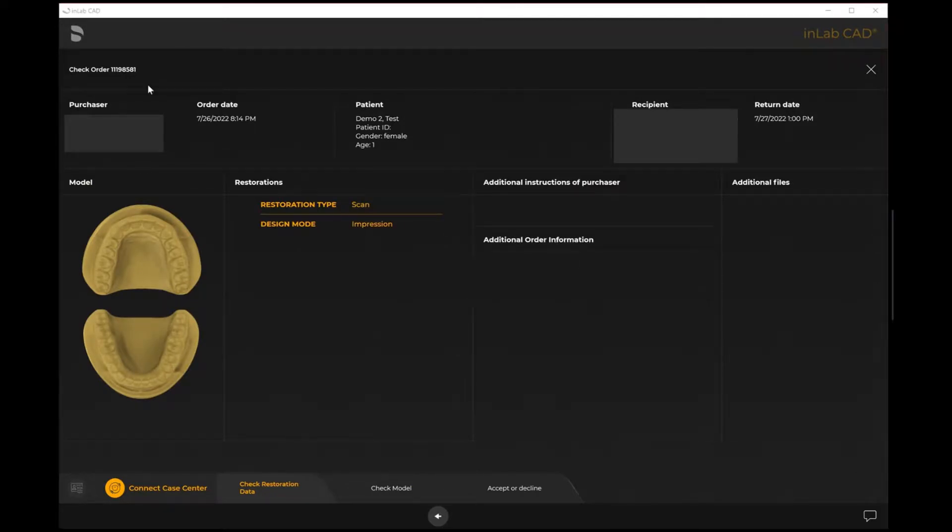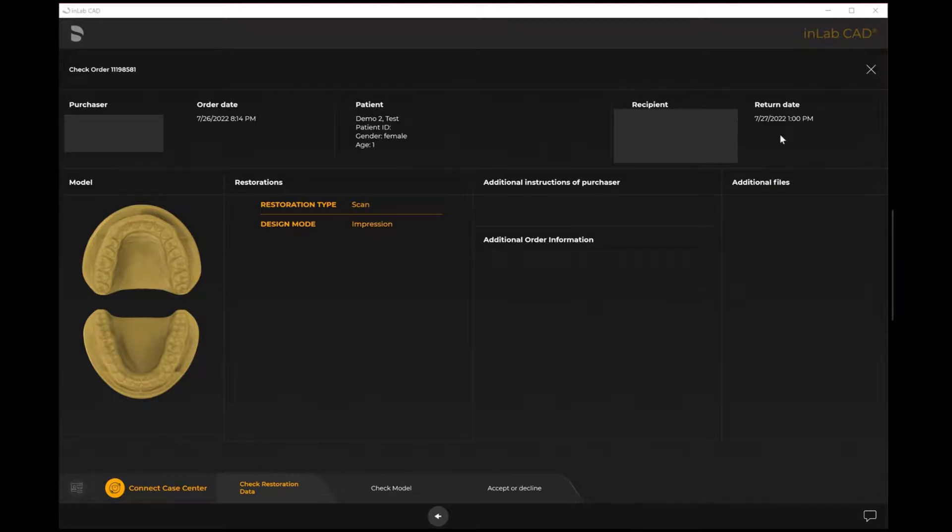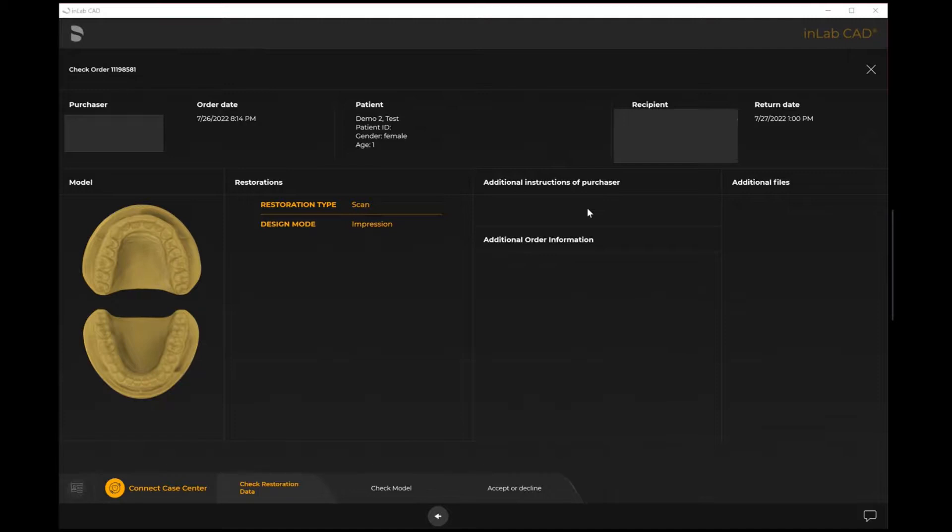At this point in time I can see here the purchaser information, I can see the order date and the patient items as well as who the recipient is and the return date that they'd like it back. If there's any additional instructions from the purchaser - maybe additional recommendations, maybe they want foil relief, maybe they have a specific shade that they want to note - any of the additional information from the purchaser will be input here.